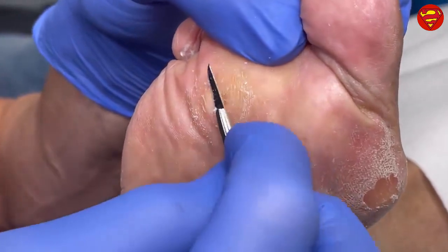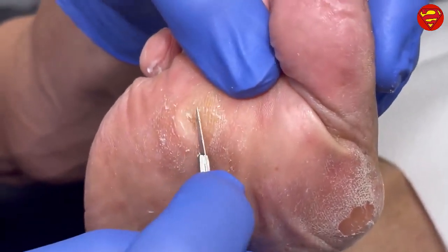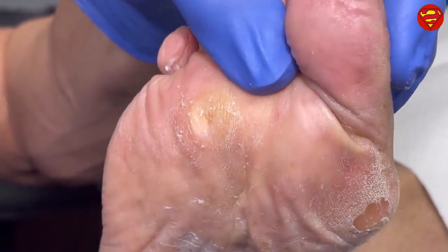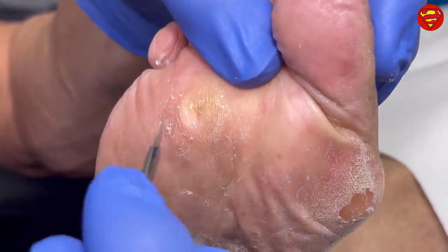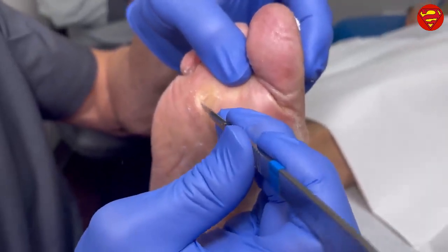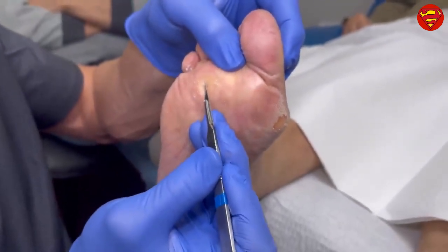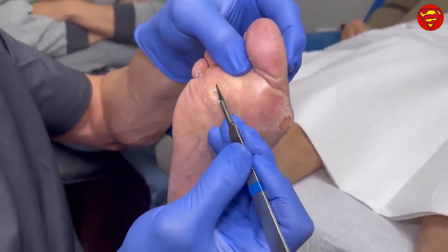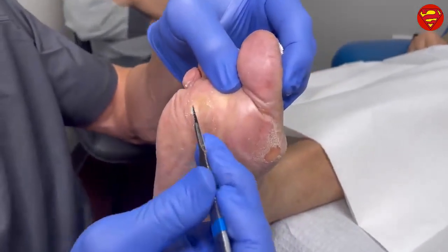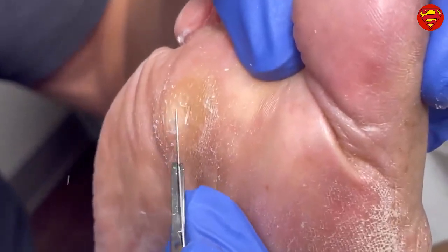And I do like to leave this rim just for accommodation purposes. If she were numb, but again, just to be very clear with the public and the world, we did give her the option. And she said, no way, no injections for me. We would be able to go even deeper. But I'm trying to be very, very careful here.